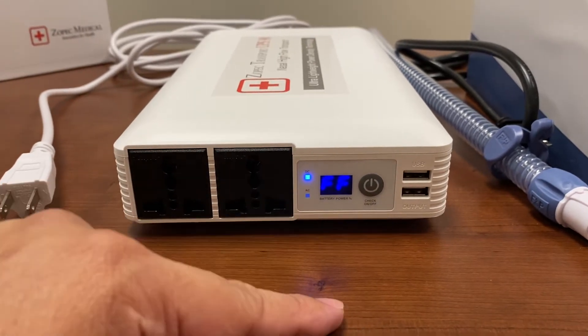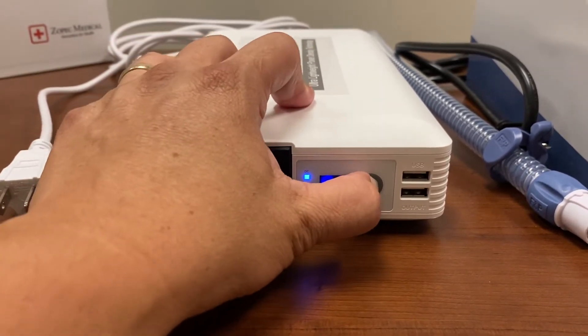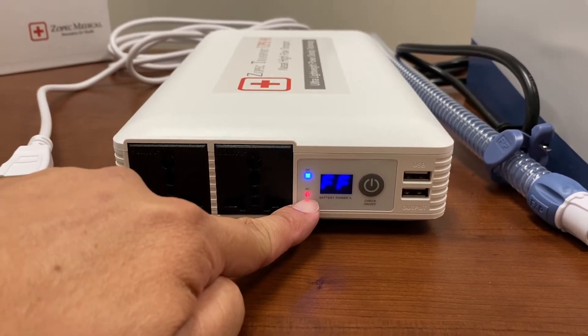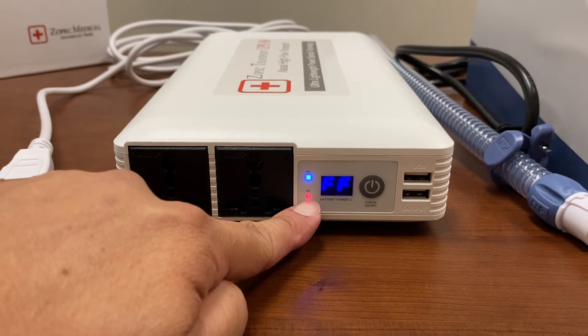To turn on the AC outlets, you just need to press the button again, and you will see that the red LED light is on, which indicates that the AC outlets are on.